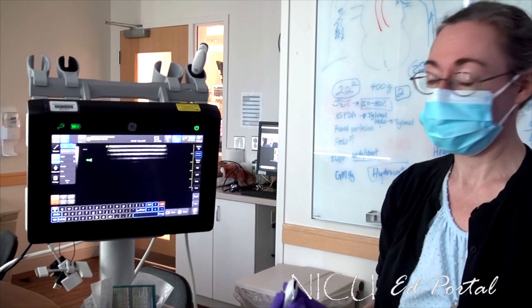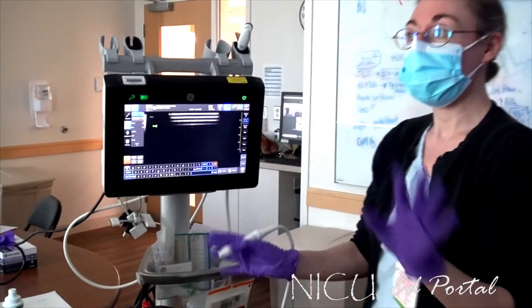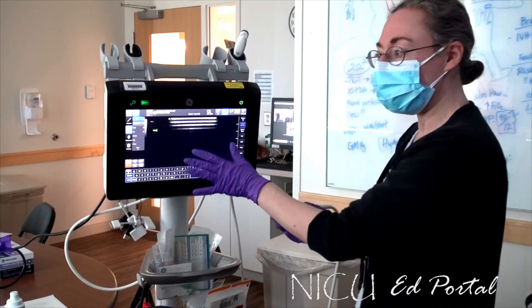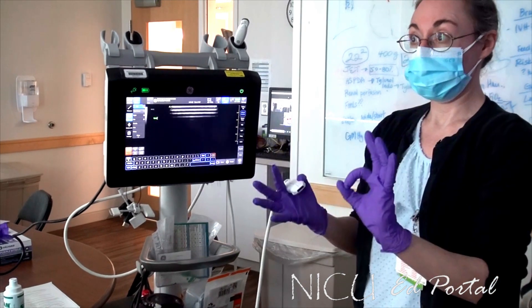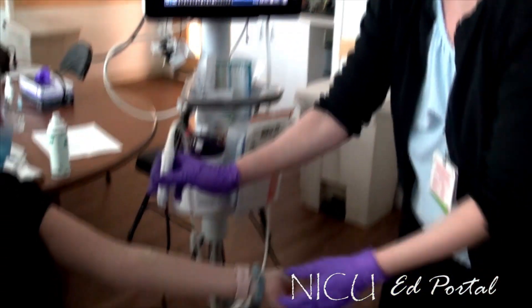So you're holding the probe with your right hand — it doesn't matter if you're right-handed or left-handed, both of your hands are working. Your left hand operates the machine and your right hand holds the probe. That's just by convention, but people who are left-handed are really good at ultrasound, so stick with it. You're going to put your right thumb on the notch.